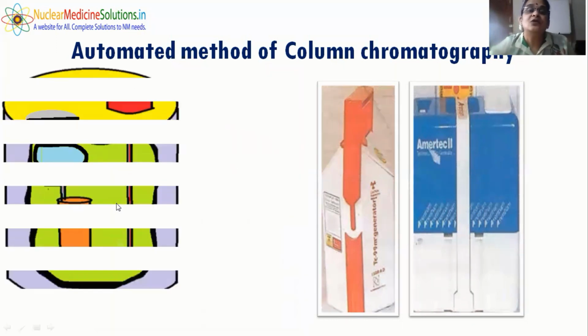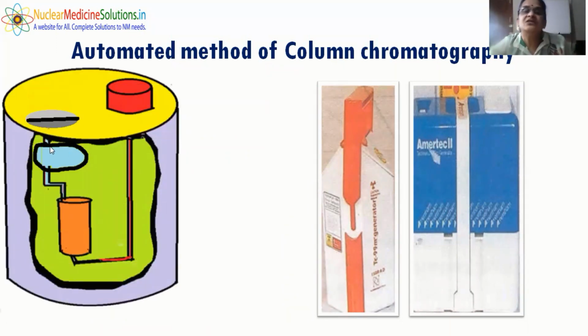It is actually the wet generator, in which even the saline has been introduced already, and all you have to do is set up the volume of the yield required, and then the vacuum vial has to be fixed into the port which has been left here. It's very much common sense, even a newcomer can get into it, but of course it's not very safe to directly leave a beginner to perform this radioactive procedure, however simple it looks.